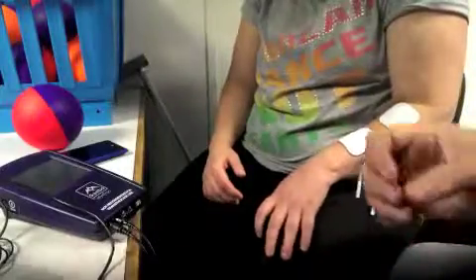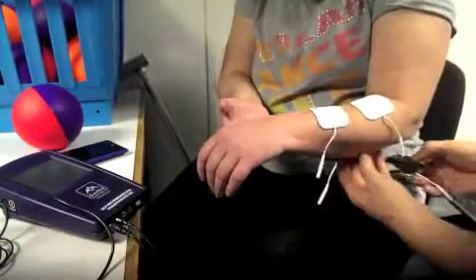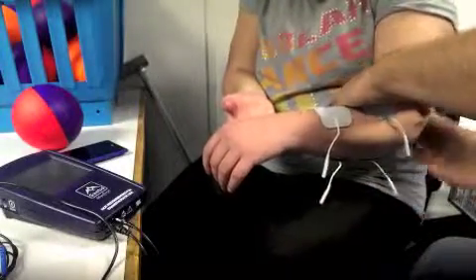These are picking up the EMG of the long finger flexors. So we have one and two, and then we have an earth. The earth can be anywhere.